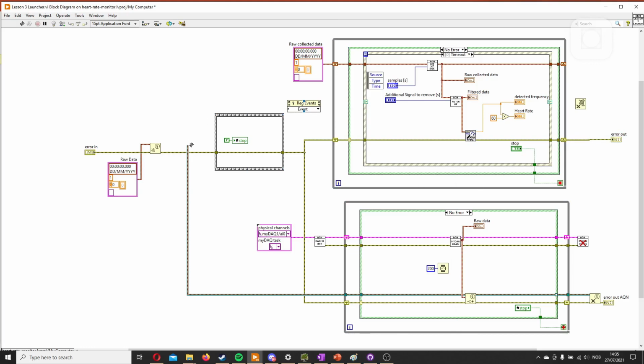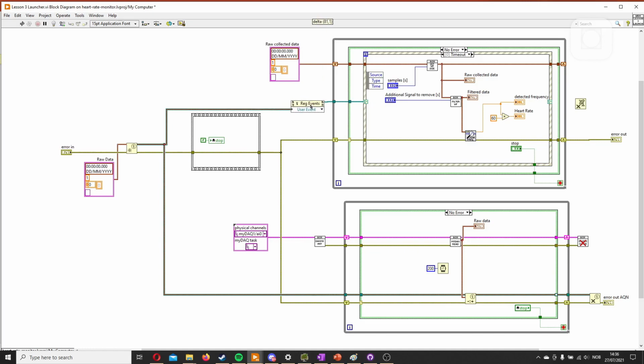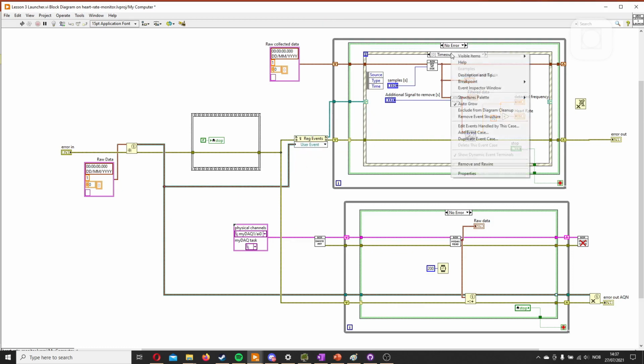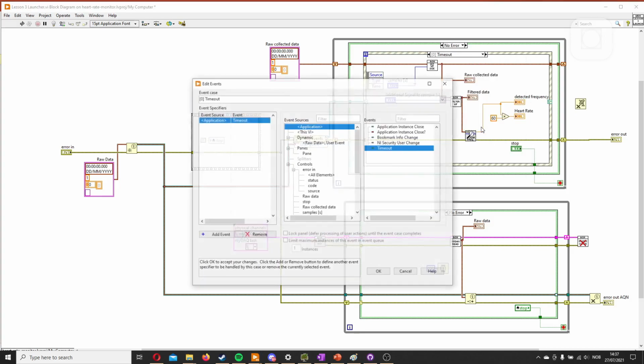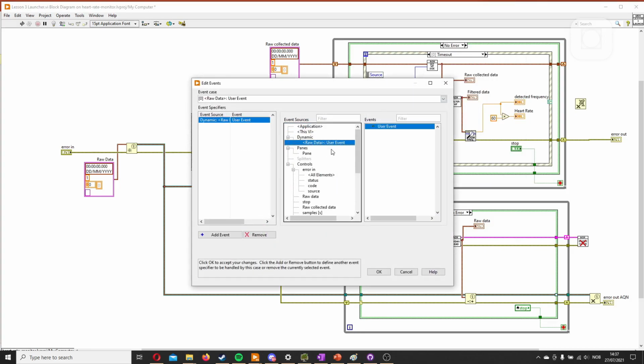To set up the receiver, we connect this one to the event. We then connect this one into this register user event, and we want to connect it to the error loop. So we'll just move it here. Usually when you make new events, you want to add new event, but we want the content of this event to just work for another thing and not the timeout, which it says here. So we'll just click raw data.